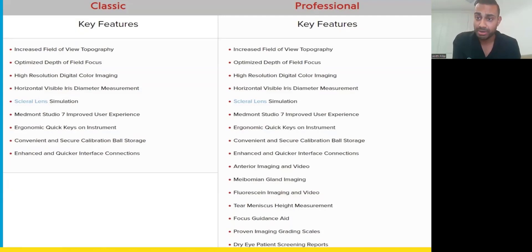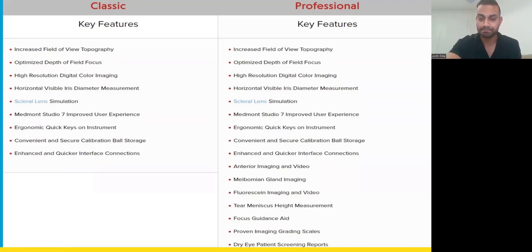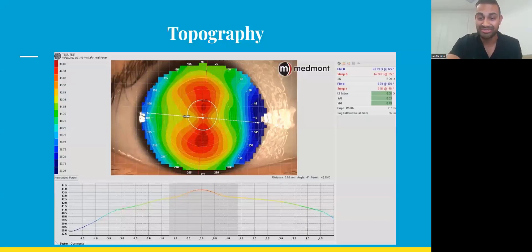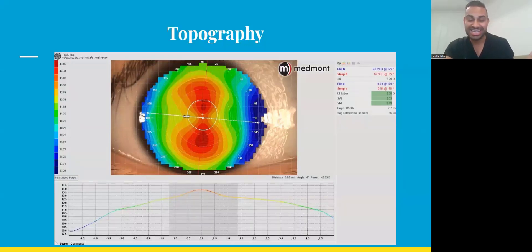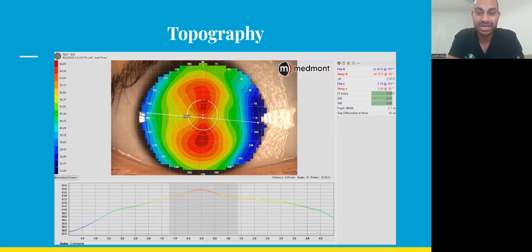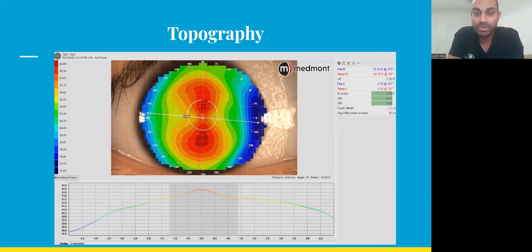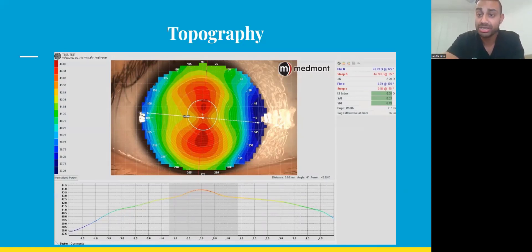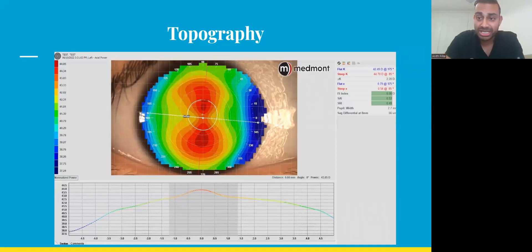With the Pro version, I can do topography on a post-ortho-K patient and then take fluorescein images of the ortho-K retainer on the same instrument, viewing everything together. This is what a Meridia topography looks like — you can see the color image, lids and lashes in the frame. You can see the conjunctival tissue, and removing the color image lets you visualize the placido rings to check for dry eye issues.